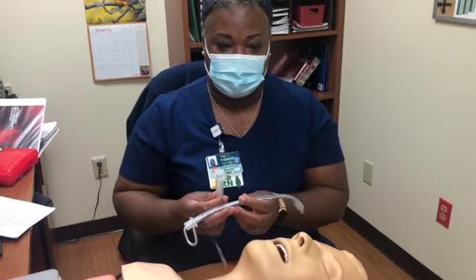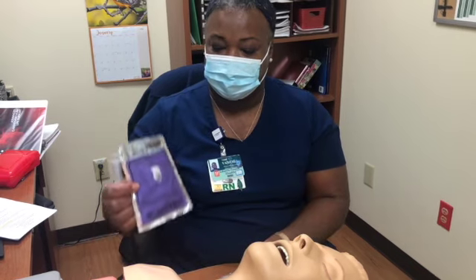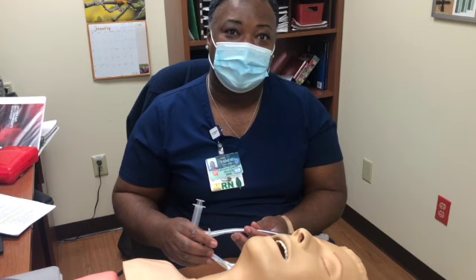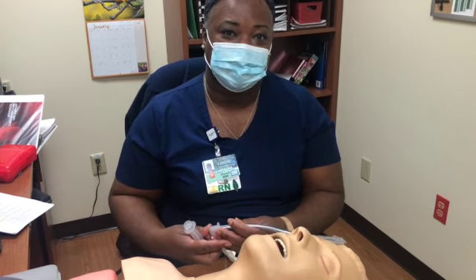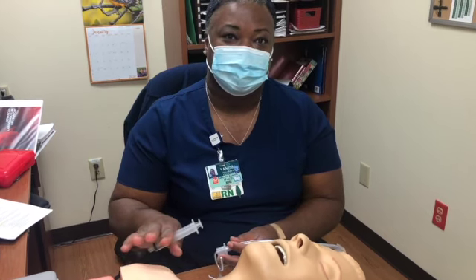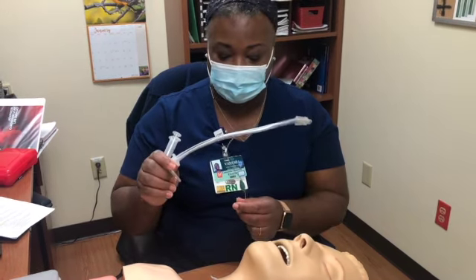After it's inserted, you're going to use the CO2 detector to make sure it is in the right place. The physician will order an x-ray, again, to confirm the placement. They will listen to breath sounds, order a chest x-ray to make sure the tube is in the correct place.